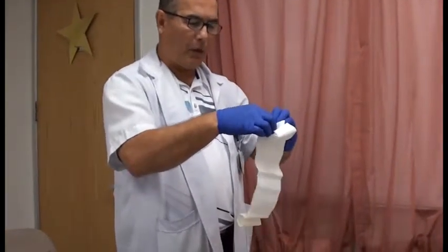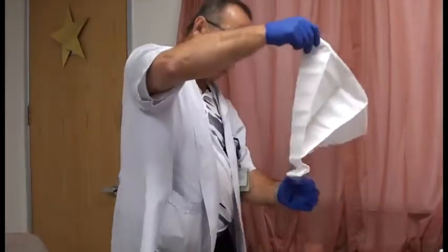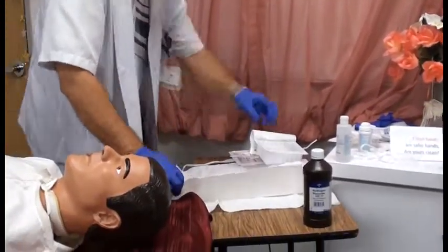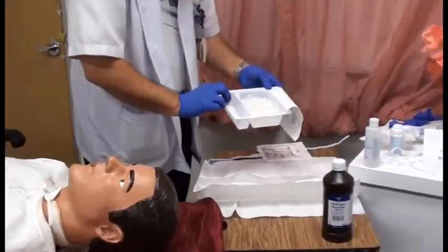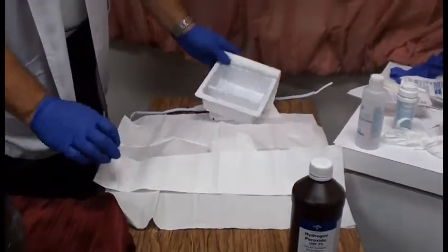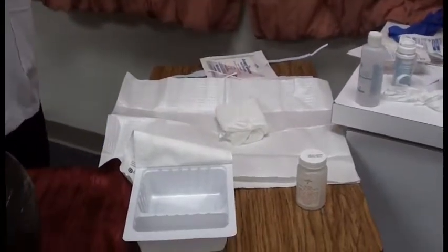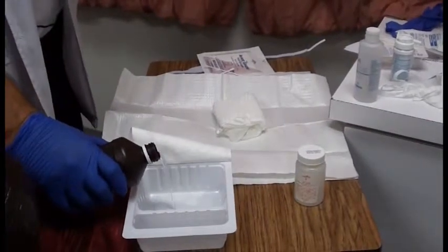And as I said, we don't really need a sterile technique, but we need to keep this area nice and clean so we don't introduce any organism or bugs to the patient. Yeah, it's almost close. Okay, so we're going to drop everything in here, in our field there. Like so. On the larger compartment, we're going to be pouring our hydrogen peroxide, about 1/2 inch to 1 inch.